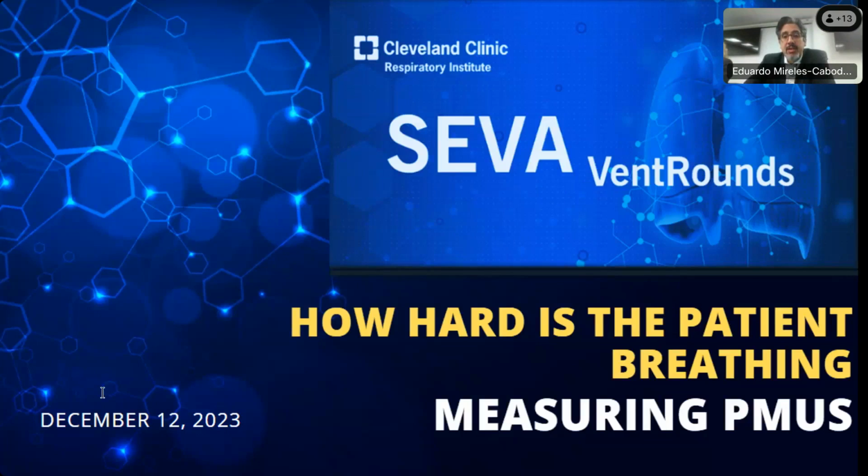There are modes in which the pressure that the ventilator delivers will remain constant in spite of the Pmus that the patient is delivering. And we know, and we have said it many times, that the Pvent is not controlled perfectly by the ventilator, but it is going to try to maintain it at the set level in spite of the pressure that the patient is generating. The two classic examples are pressure control and pressure support, in which there's a set point. You set the amount of pressure that has to be delivered by the ventilator, and that's what you're going to see.